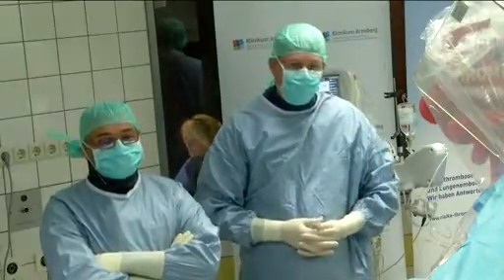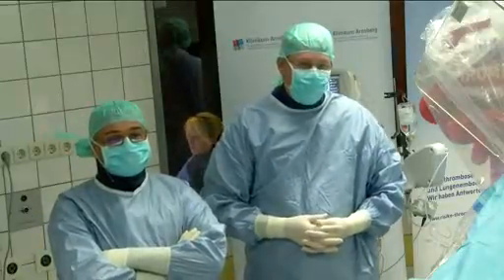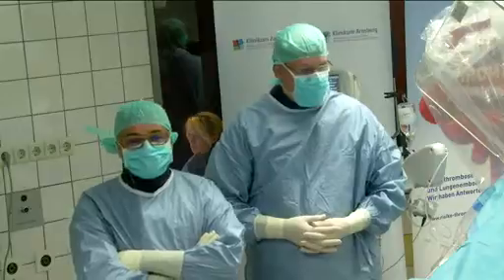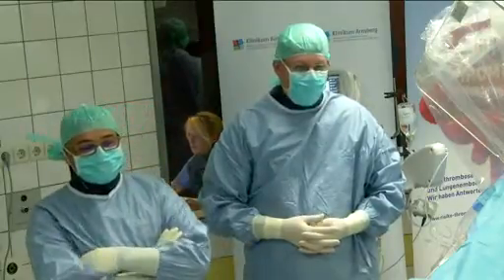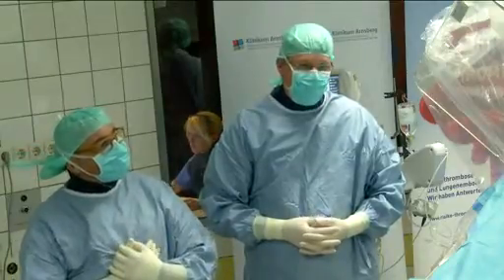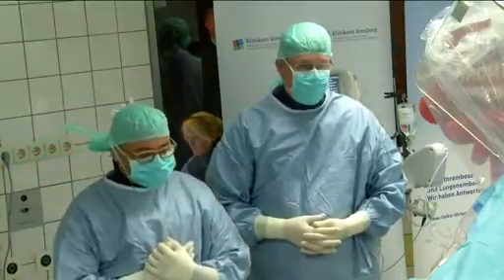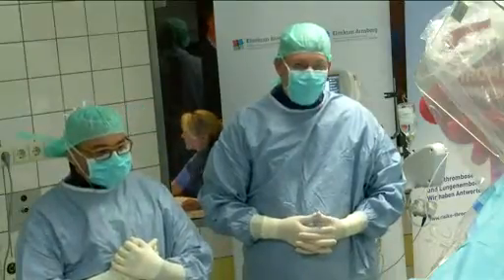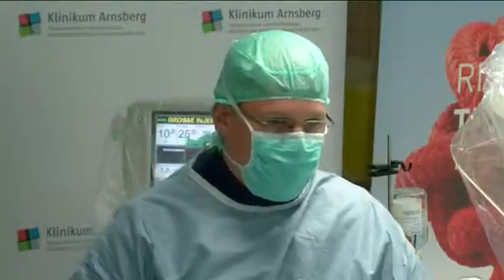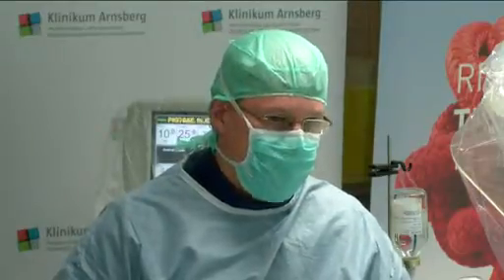Just want to briefly summarize our next patient. It's a 51-year-old male patient who had a bypass graft implantation 7 years ago, and now he experienced problems while walking. After 50 meters, he felt leg pain in the lower part of the leg, and as we performed ultrasound, we saw a fresh to subacute occlusion of this bypass graft. We now intend to recanalize this bypass using rotational thrombectomy, the Rotarex system, to really perform a mechanical thrombectomy of this occluded bypass graft.